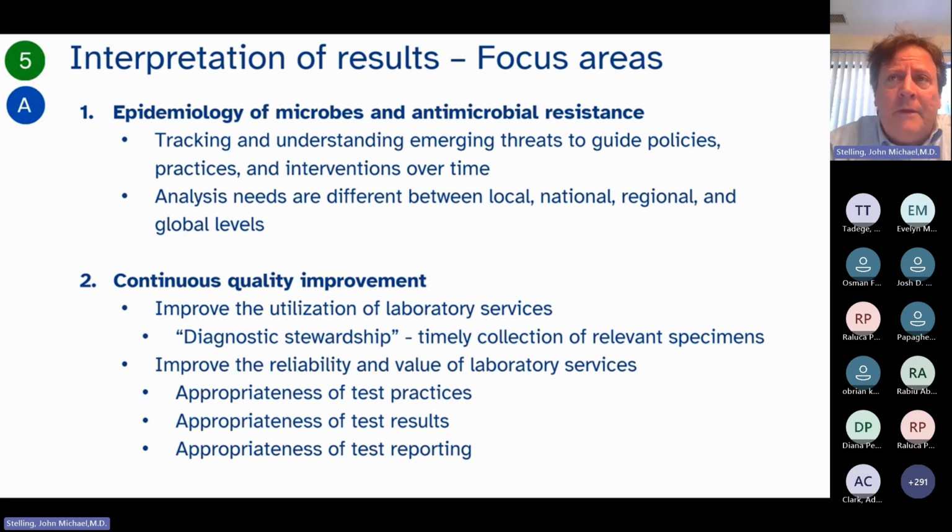And then percent positive. In my own hospital, about 10% of our blood cultures are positive. About half of those we consider to be contaminants, and about half of those are real pathogens. But in some laboratories, it might be 20 or 30% positive, which might be consistent with high rates of contamination.